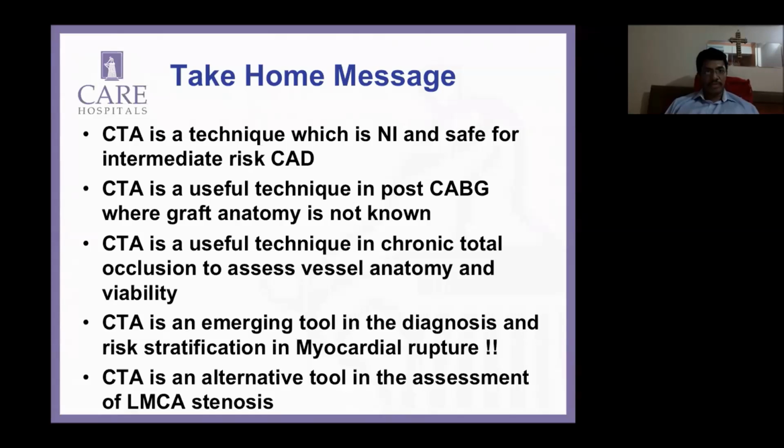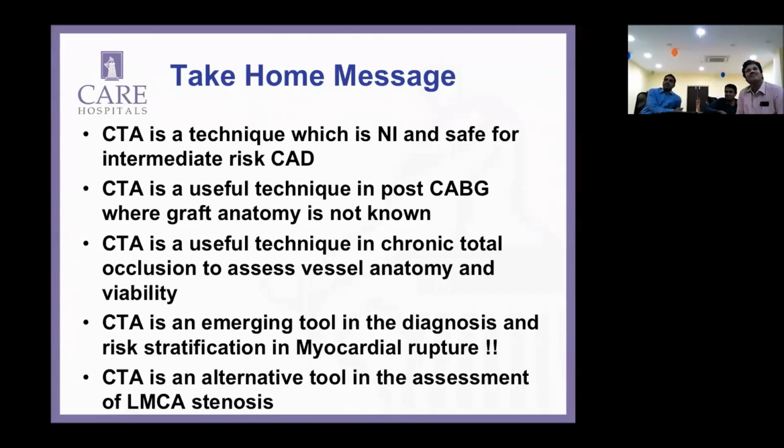Thank you, sir. I have a question. Regarding viability testing, which you have recommended, viability testing through CT, where are we in the present scenario? You are the best person to say regarding MRI, PET, and CT, which you would recommend.